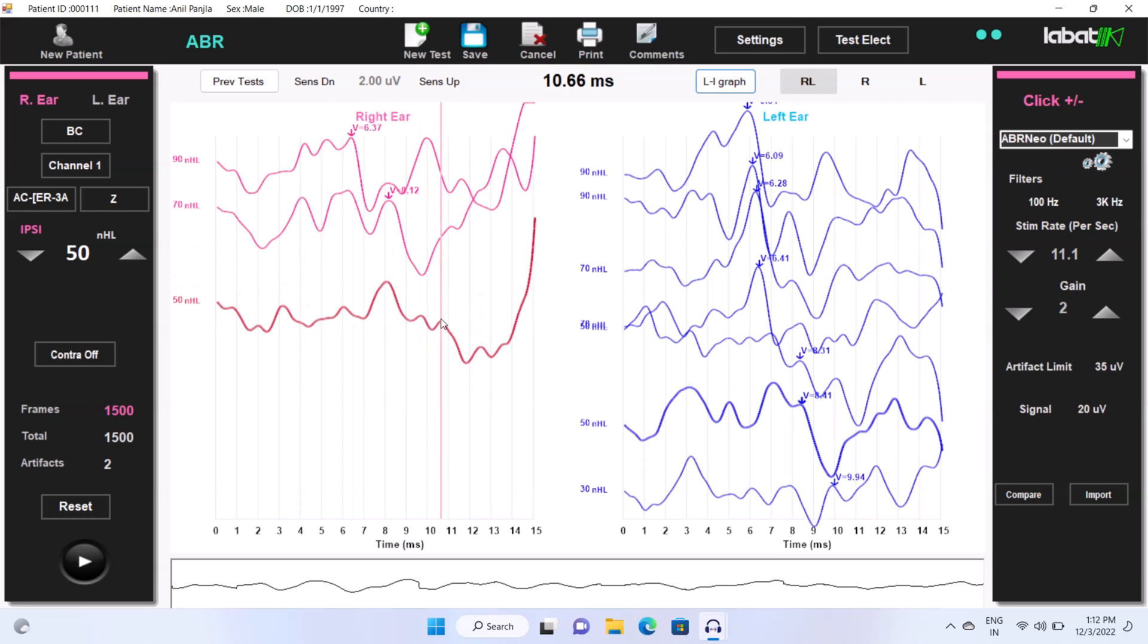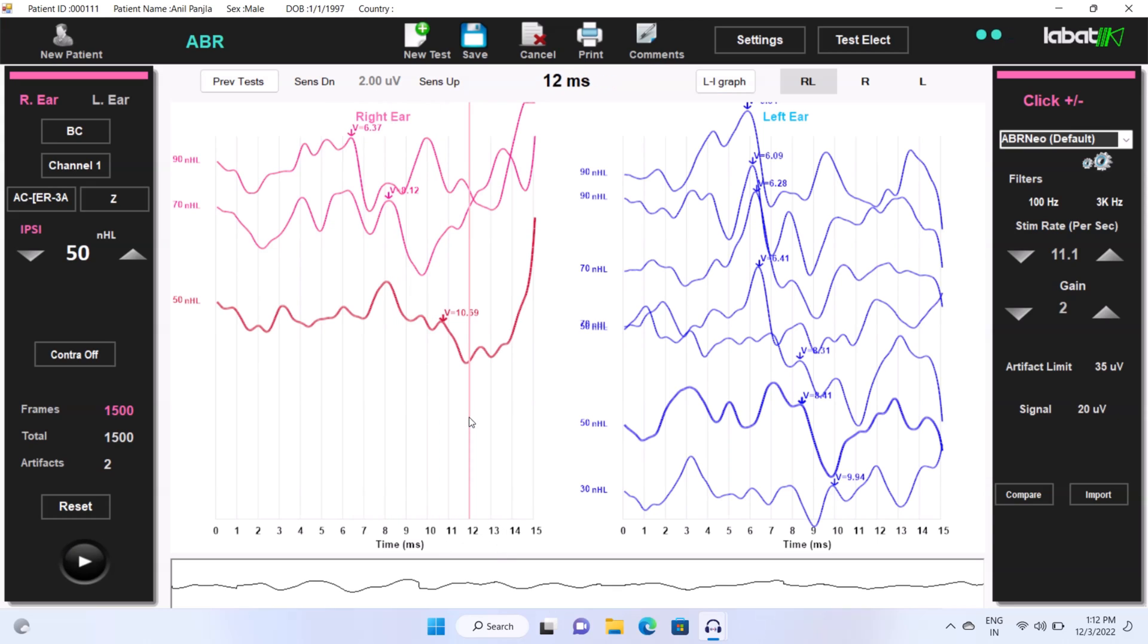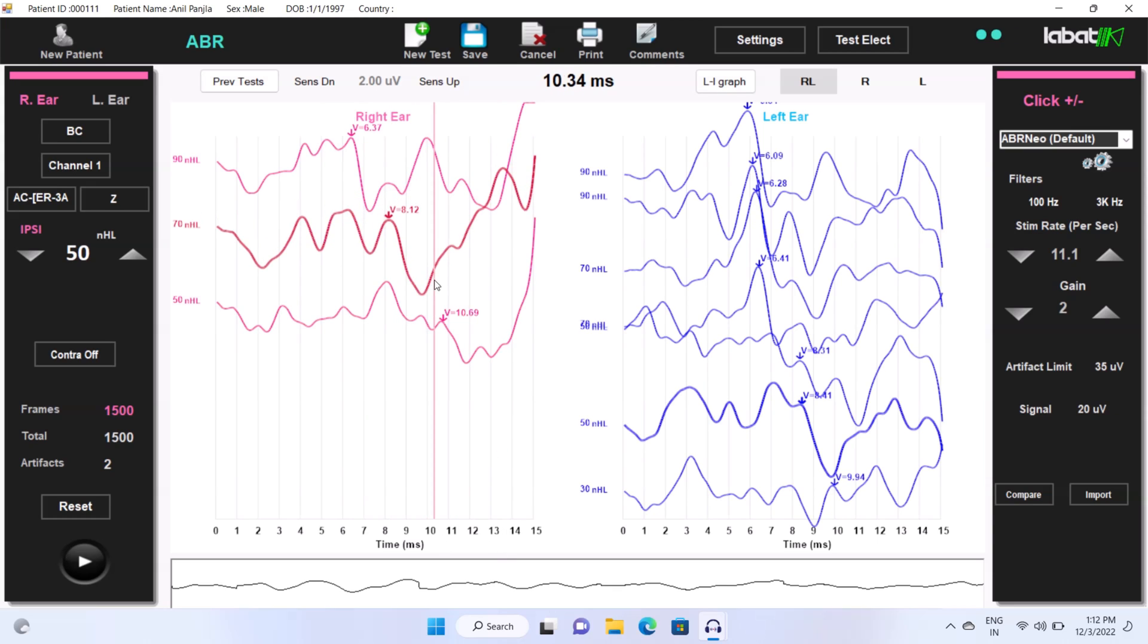After getting both ear traces, you can see the difference in between both ear responses. You can mark the traces manually or you can also put it on automatic marking.